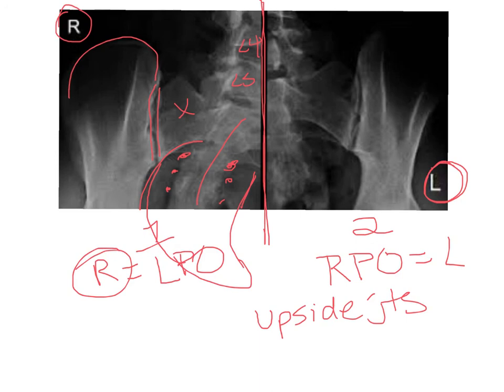Minification will only occur in digital processing. You will never see minification occur in film radiography, but basically we are shrinking an image down to fit onto a page or a piece of film through digital processing.